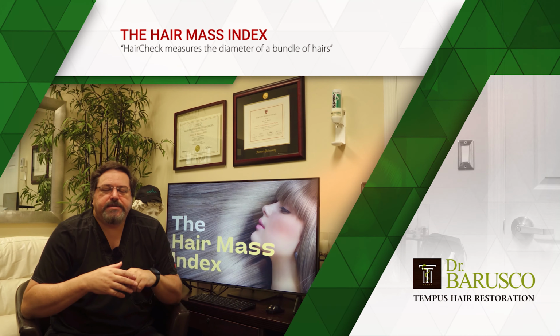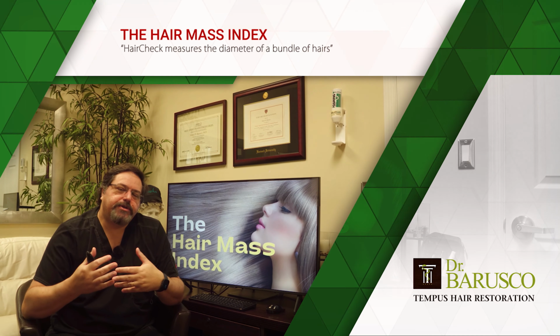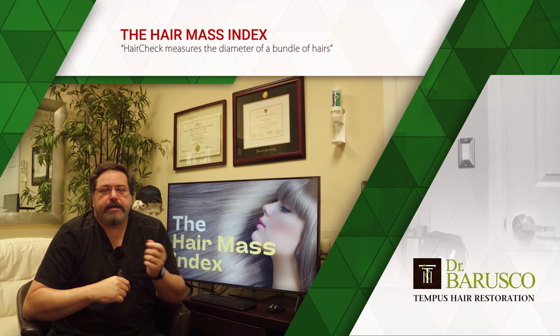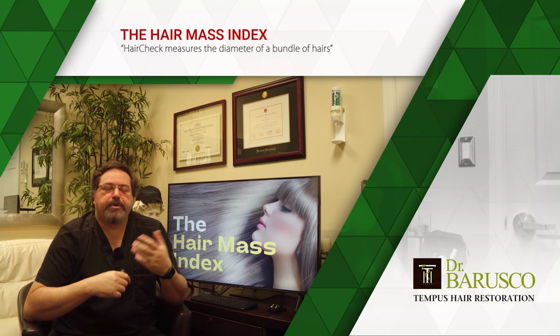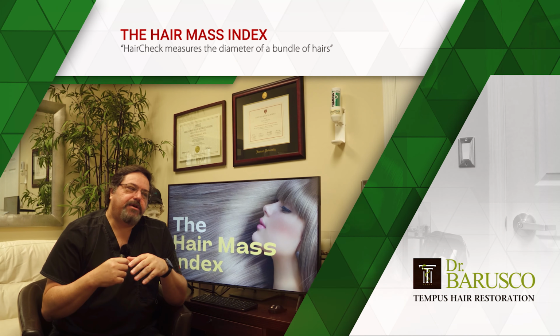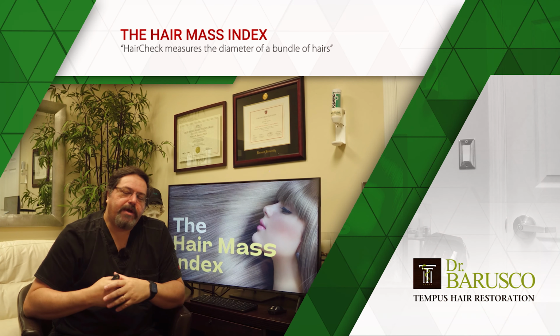So today's theme is hair mass index. What that is, is a little tool that we use during your consultation and during your evaluations and follow-ups. And it gives us an idea of the effectiveness of the treatment for your hair, both with transplants, but more importantly with medications. It gives us an idea of your hair loss, what it looks like at baseline and also as we progress with time.